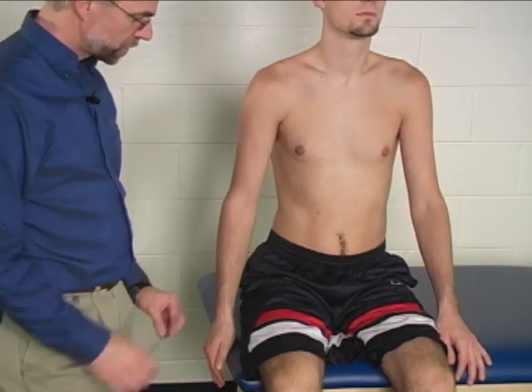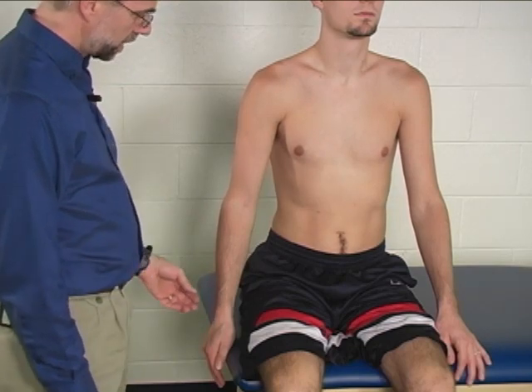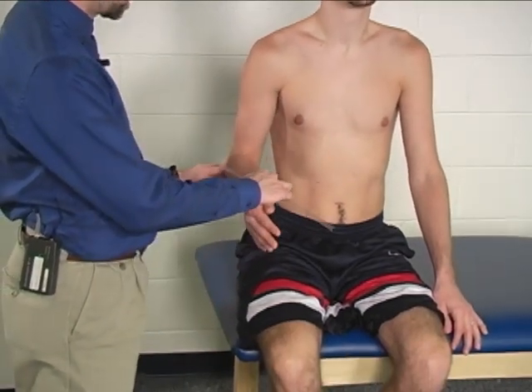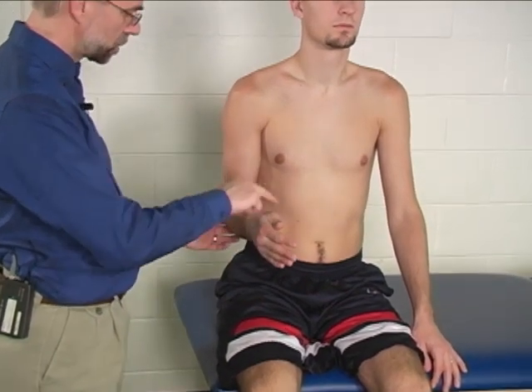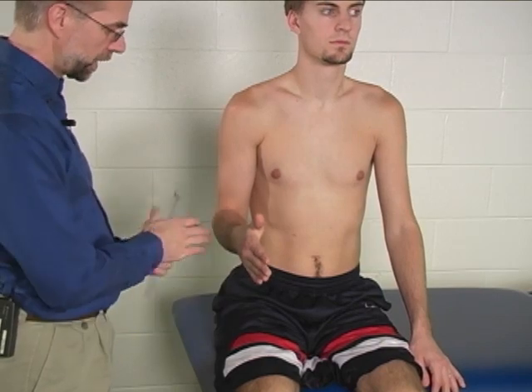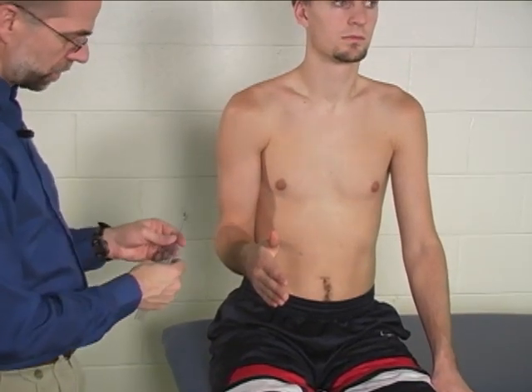To measure active range of motion for forearm pronation, the patient is seated, the arm is adducted at the shoulder, the elbow is placed in 90 degrees of elbow flexion, and start in neutral pronation/supination.